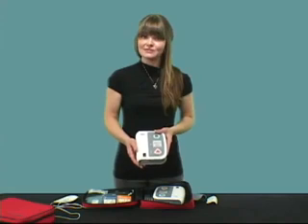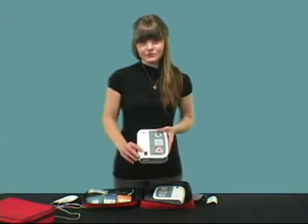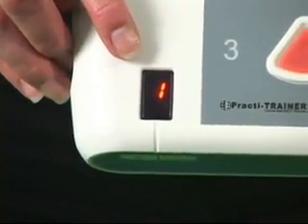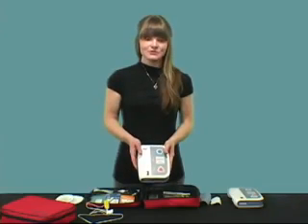To use the trainer, first choose one of the eight different program training scenarios. The indicator on the lower part of the front panel identifies which training scenario is selected. Let me demonstrate how it works.